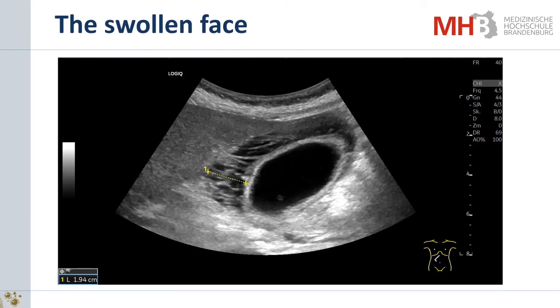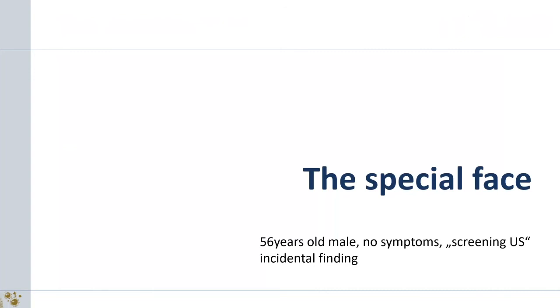And if you decide to operate on such a patient, this would be a very big mistake and can cause complications for this patient, because he has an acute hepatitis, or in other cases, another acute disease causing this edema. Therefore, our clinical evaluation will help us to avoid a wrong diagnosis. This is edema, but not related to inflammation.